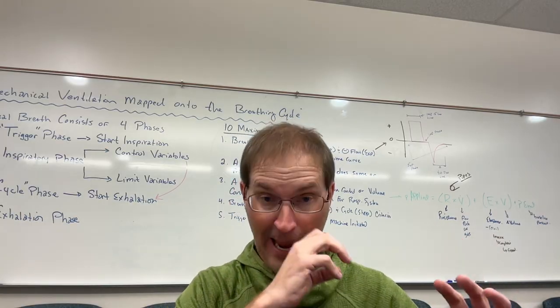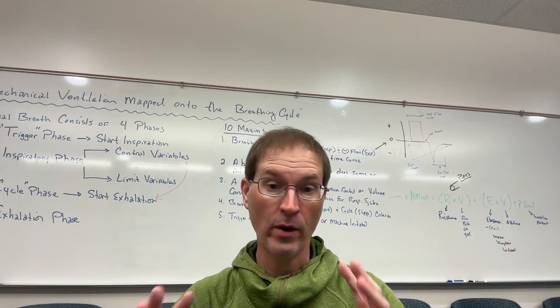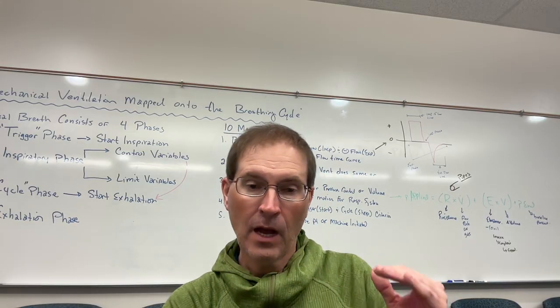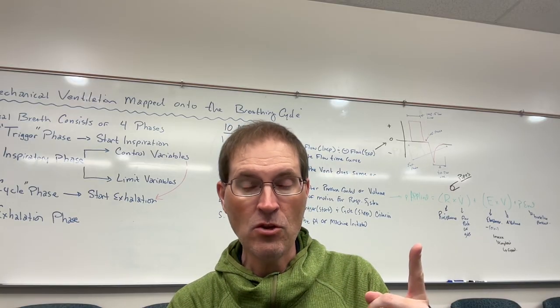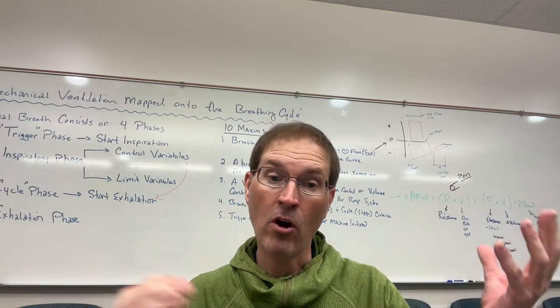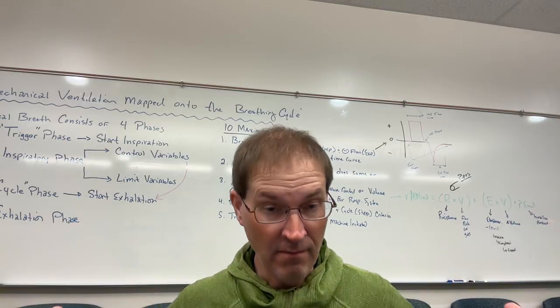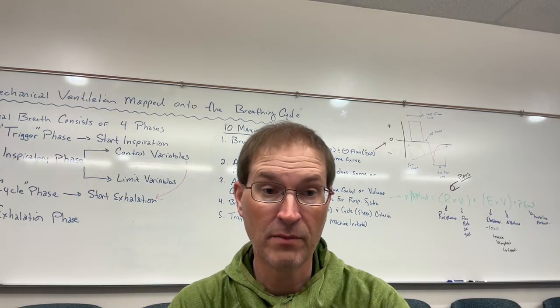But at the end of the day, what is happening at a physiologic level is going to be related to what we're talking about here in the next couple of videos. That is to say that ventilator A may be doing the exact same thing physiologically as ventilator B, even though there are different naming schemes. And so to understand what's going on, we need to understand the foundation. The foundation really comes down to these 10 fundamental maxims of mechanical ventilation.